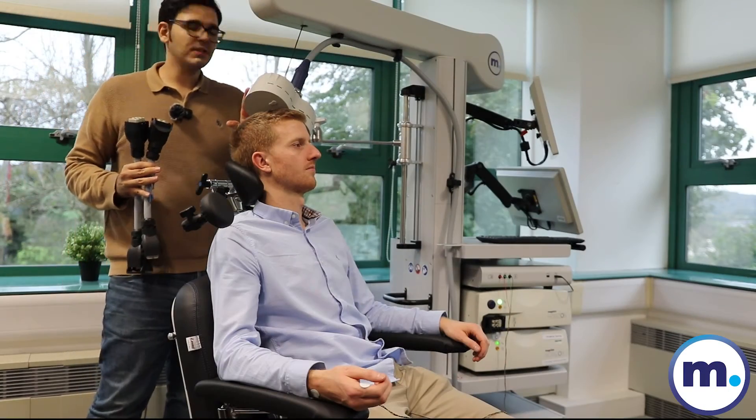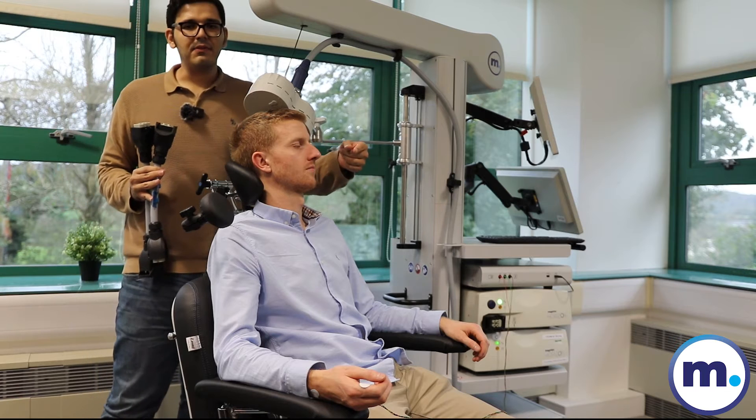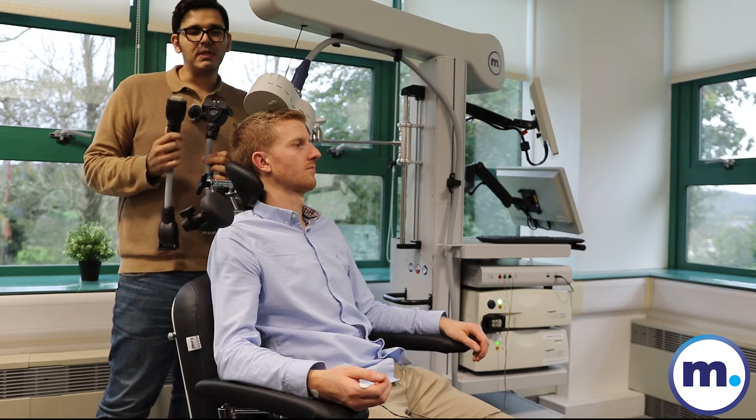We have an EZ coil here connected to a Horizon device and we are measuring the MEP response on the FDI muscle. The coil is adjusted on the cortex motor or M1 point. We will try to measure MEPs with two adapters: the real adapter and also the sham adapter.